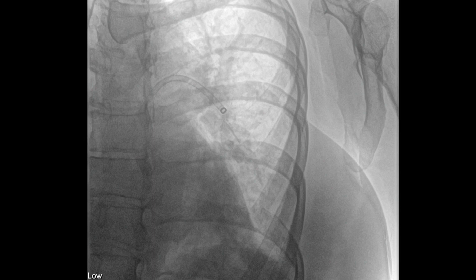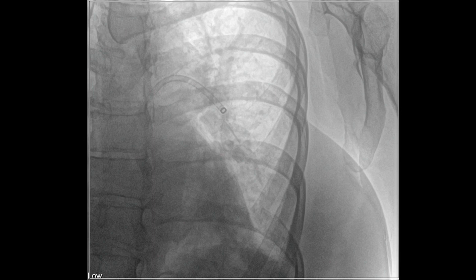We accessed the right common femoral vein under ultrasound guidance. This was done with a mini-stick needle followed by the wire and a micropuncture sheath. We then upsized to a 6-French sheath over a wire.